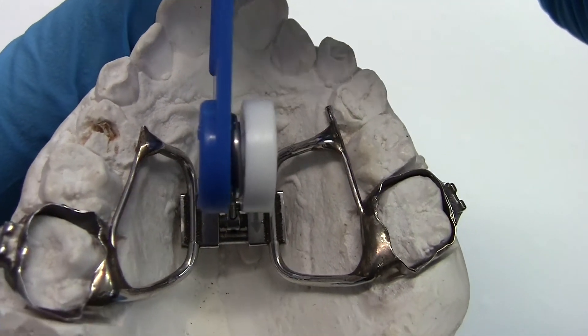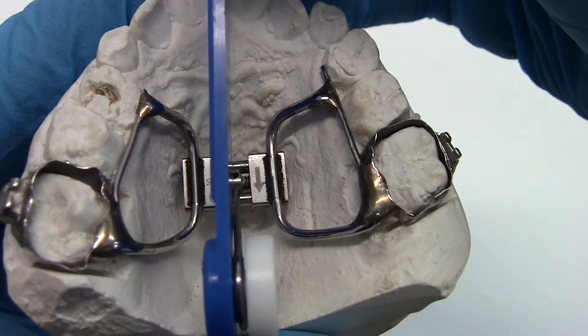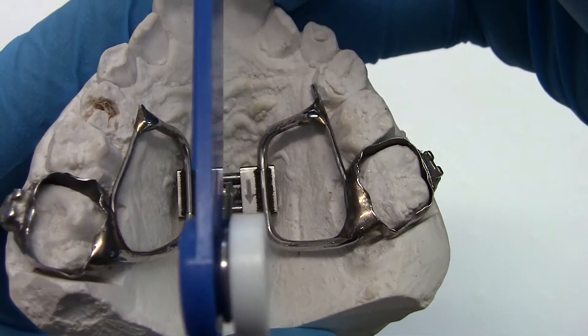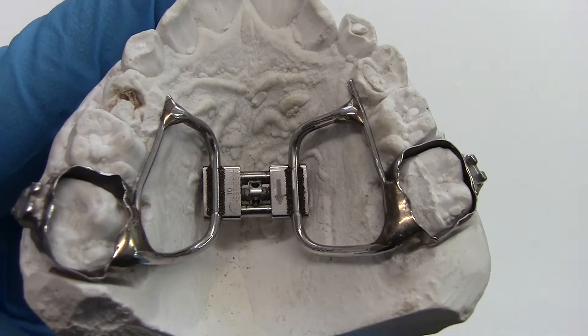Push the key towards the back. Stop when the handle will no longer go any further. Remove the key by pushing downwards and backwards to avoid undoing the turn.